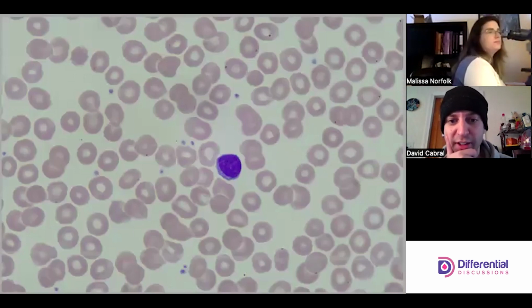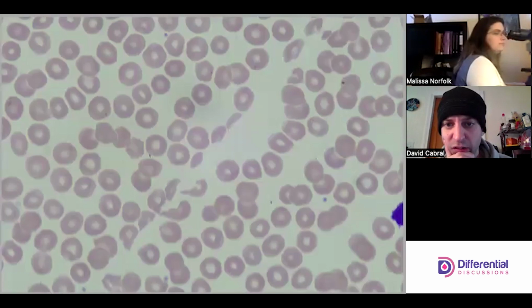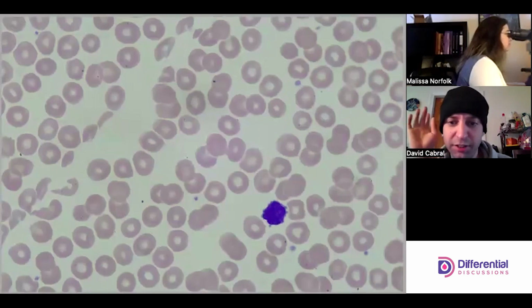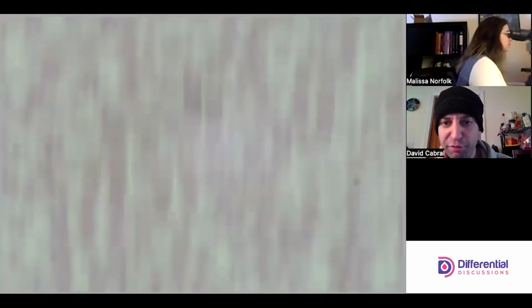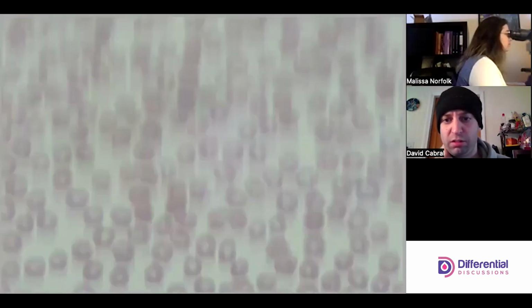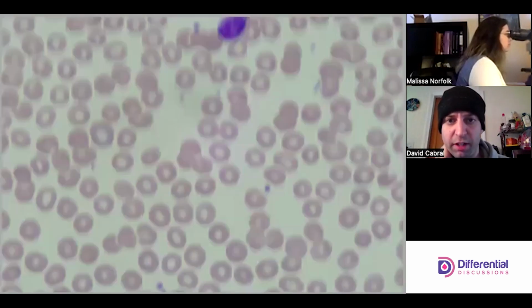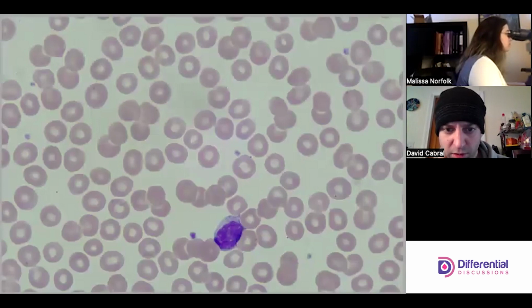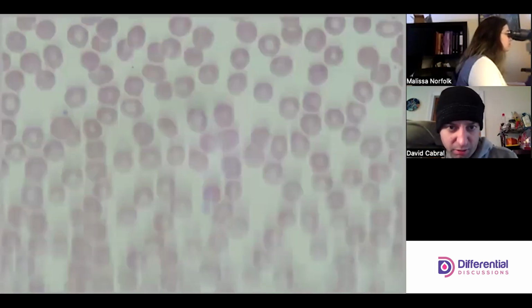Looks like a normal resting lymph. What's up, fella? Paying attention to the little projections on that lymph, but nothing too crazy. Yeah, and I'm loving my red cells. My red cells look great. Okay. Yeah. Little stretchy, little grabby, but nothing crazy.